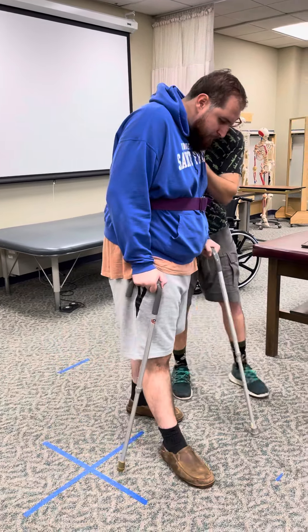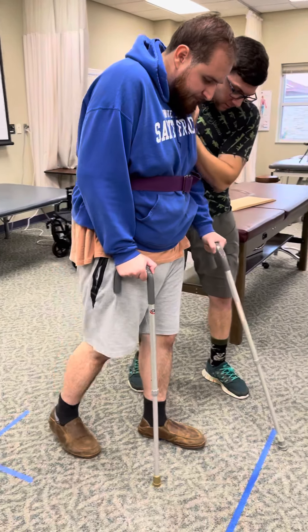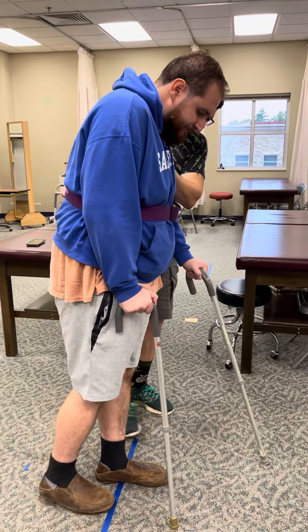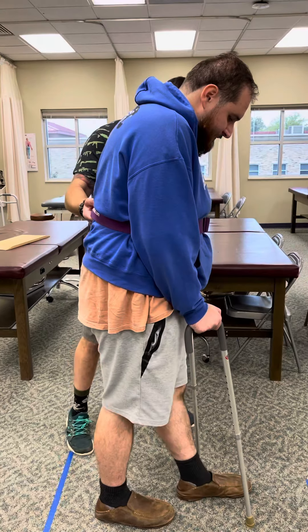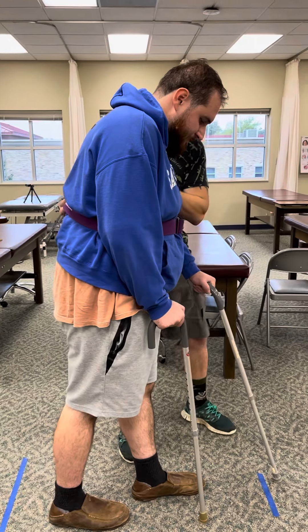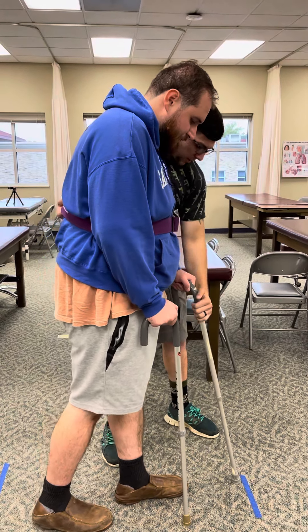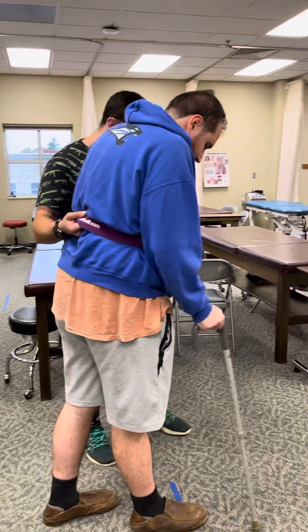Now keep that device a little close — you're taking real big steps. Take smaller steps for me. Make sure you keep that base planted out and bring that cane in. Don't put the cane out so far. How about right by here?